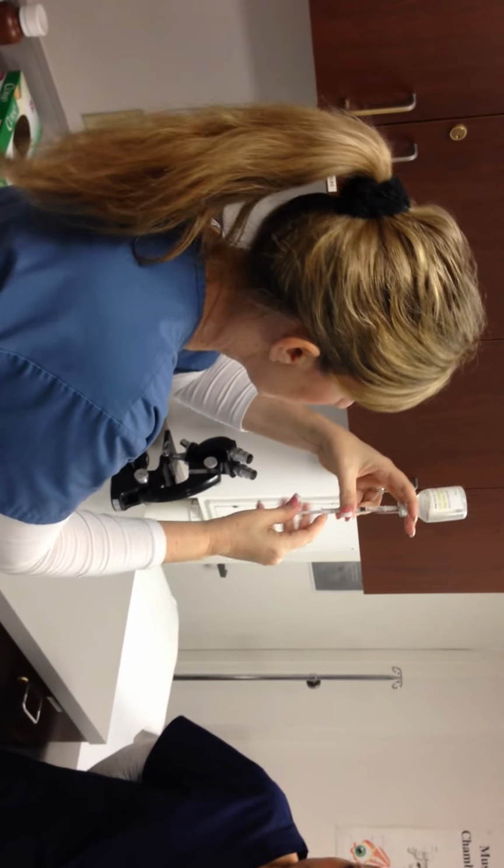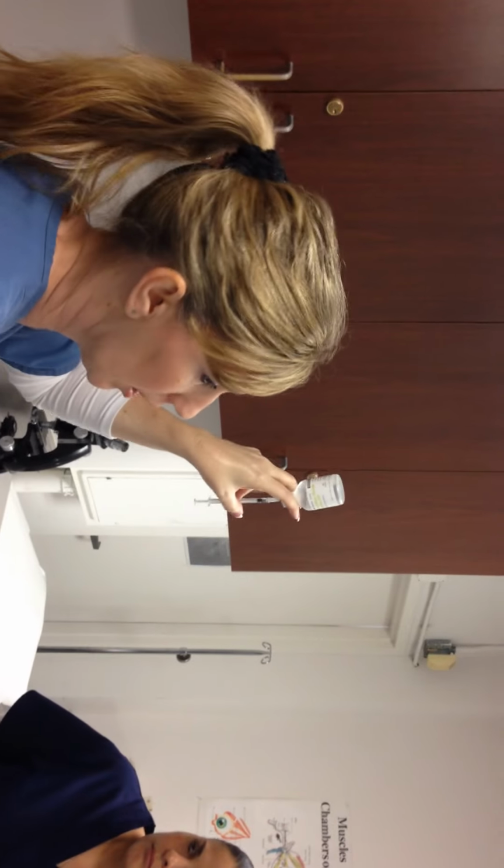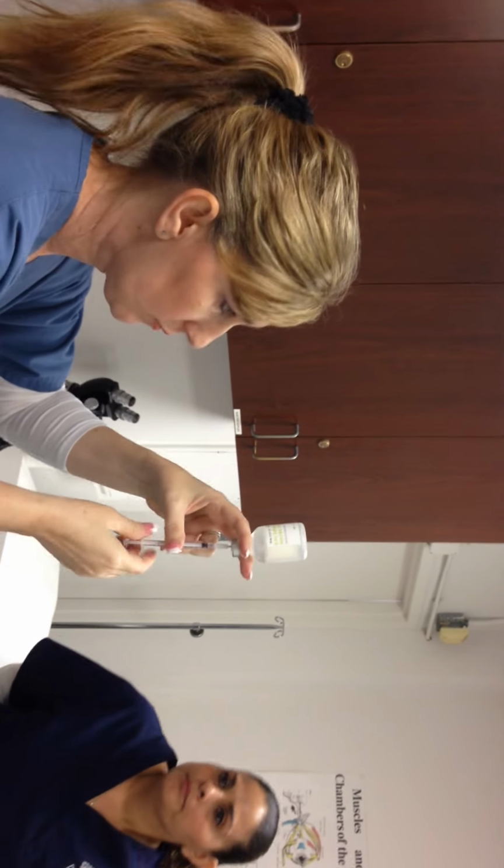Need to get rid of the bubbles, just kind of go like this. And then we're going to push it back up until we get to the 0.1 marker. You see that? And we take it off. Boom. Set it down. And what are we using to cover it?